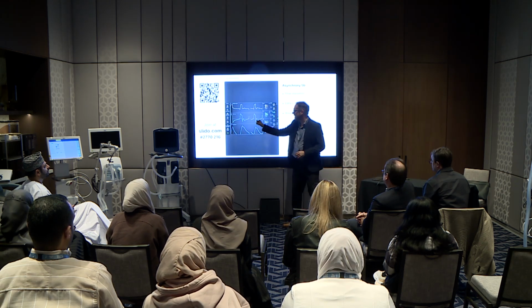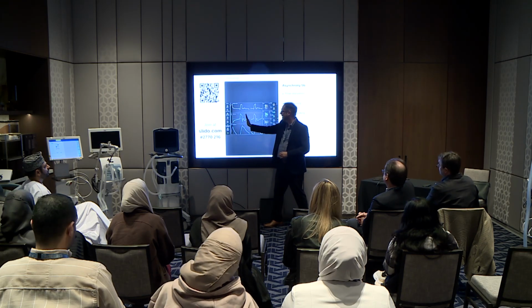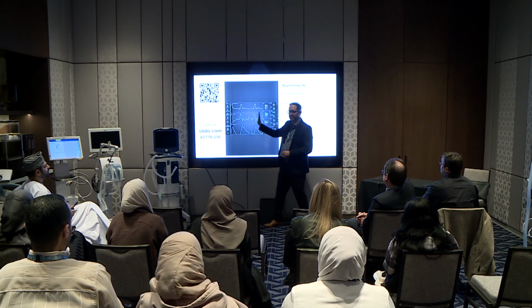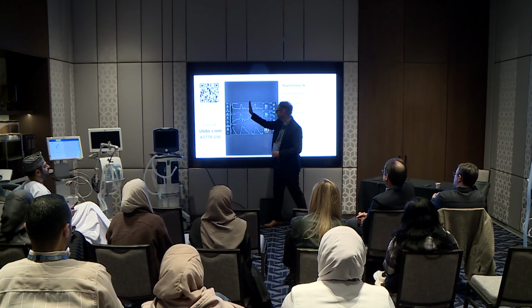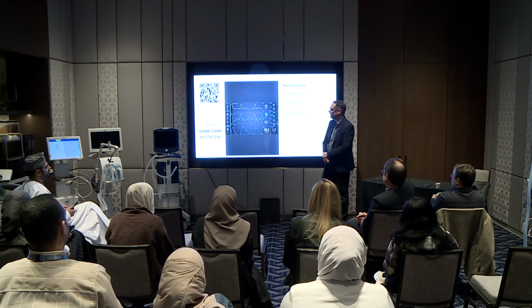And just in case anyone's wondering what's going on here, the ventilator goes like this across the screen and it overlaps. You can ignore this part right here, it's just the cursor going like this as the patient's being ventilated.